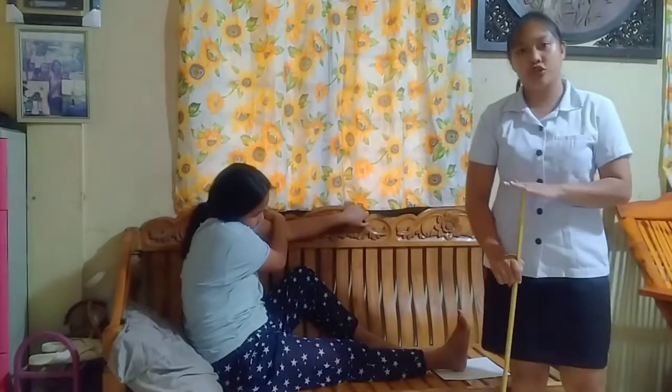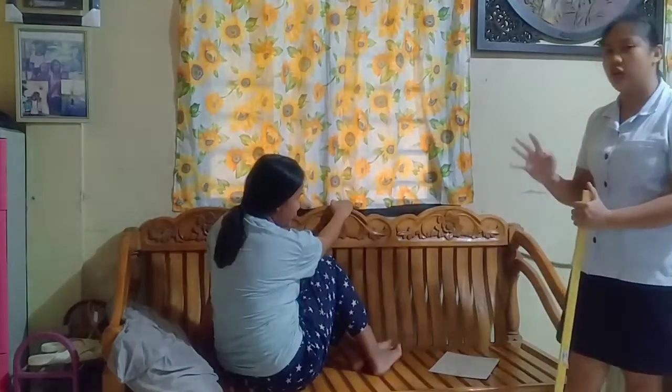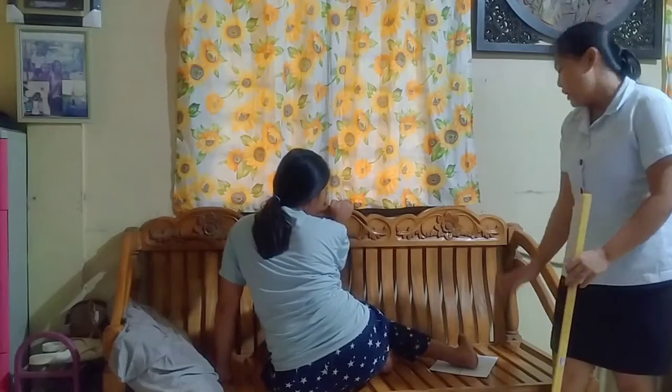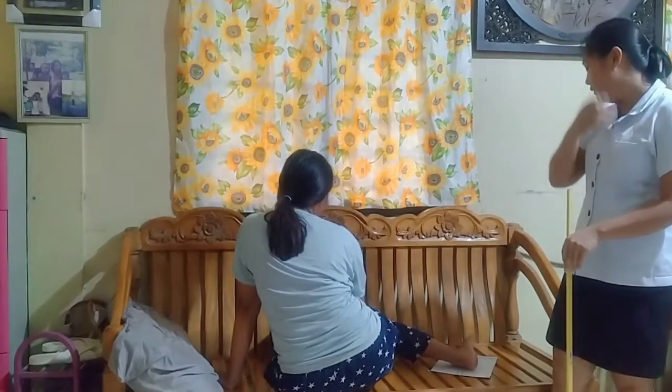Now, next projection will be the lateral projection of the ankle, the lateromedial. Now, instruct the patient to turn towards the unaffected side.